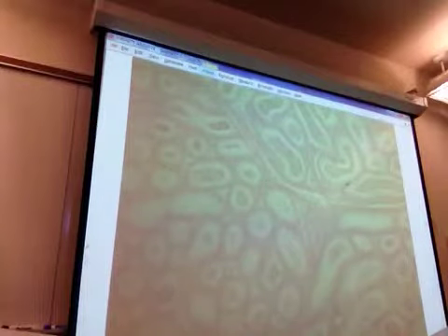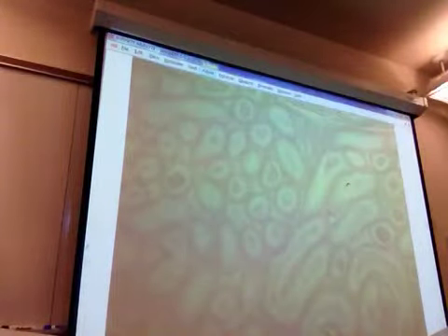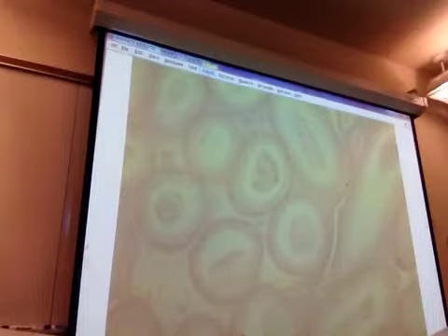The cells are staining pinker, and that's because of the type of secretions and the different acidity in the compartments, right? Notice that you've got the bundles and they're arranged a little bit more regularly, so you've got definite groups of tubules. You can definitely see cilia on those cells.